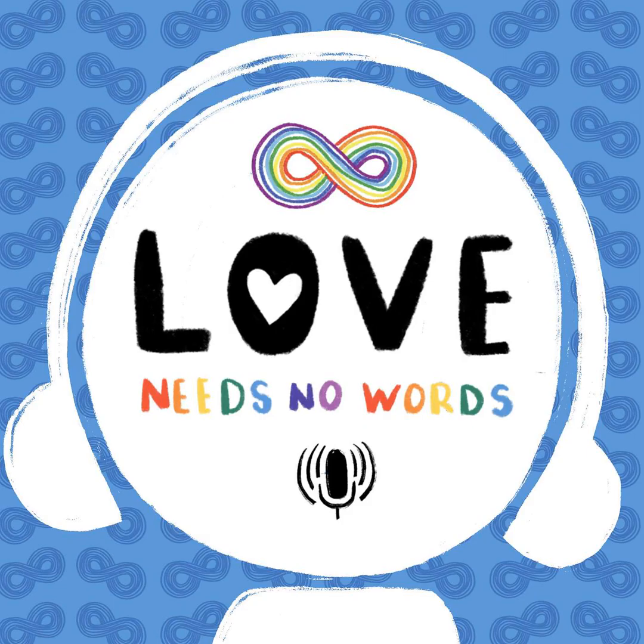And it's not instead of, because they'll look at this thing and they're going to go, this is not as good. This is not Hey Dougie. What is this? And they will be very cross and frustrated, quite rightly, because they think you've just taken away one of the things that they love most. So you give them both, and you let them have both, and that makes that process of starting AAC and introducing something new and different just that first step.